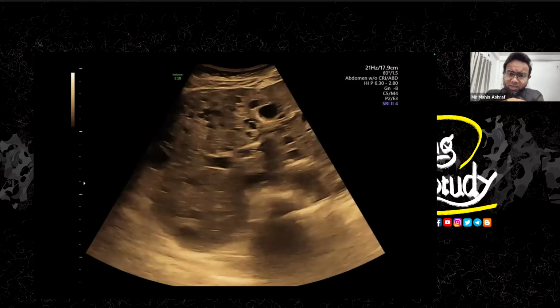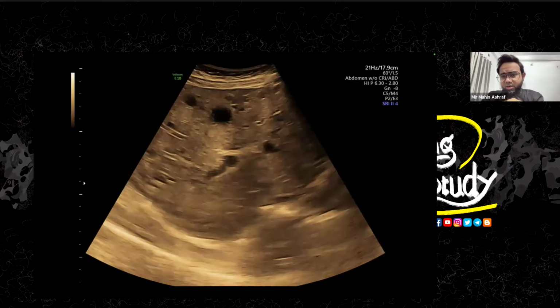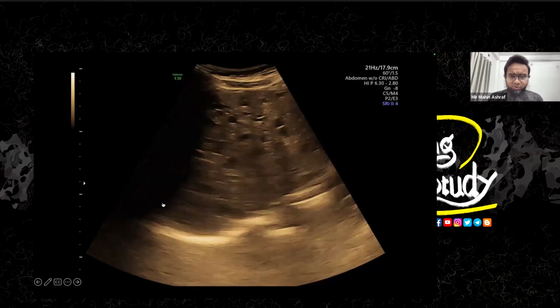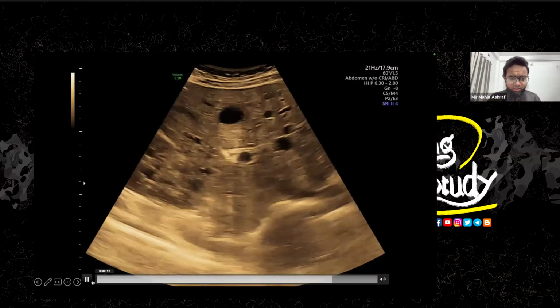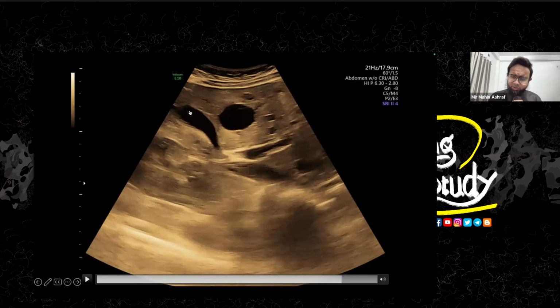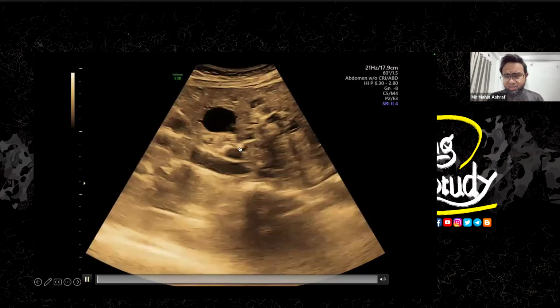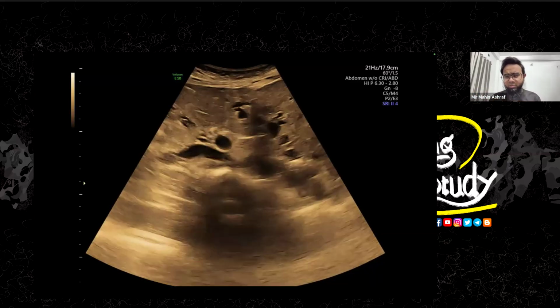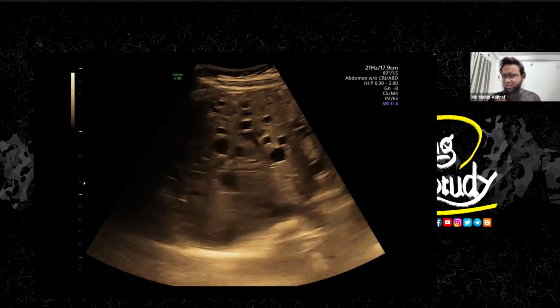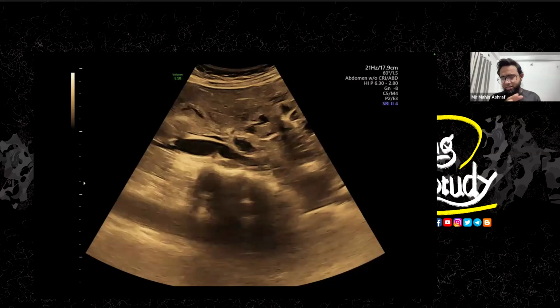When we jumped into the hepatic ultrasound, you can see the diffuse cystic appearance of the hepatic parenchyma. You can see the gallbladder here. It was very difficult at first to see the liver and find the gallbladder among these whole cystic lesions. So we froze the image. You can see this one is the gallbladder. It is a pear-shaped structure. But these round anechoic structures are nothing but the hepatic cysts. These are multiple hepatic cysts throughout the hepatic parenchyma, which suggests polycystic liver disease, I think. There is a differential of Caroli disease, which has slightly different features.